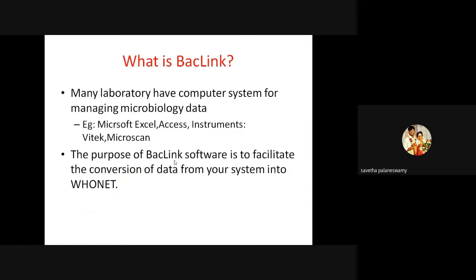Some of you still may not know what the WHONET software is. In most hospitals or tertiary laboratories, they are using Excel for entering antibiotic surveillance data. Many are also using the Vitek automated machine, which itself generates antibiotic surveillance data.